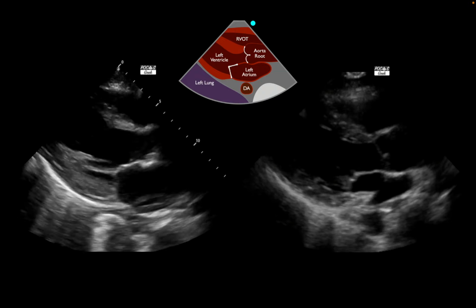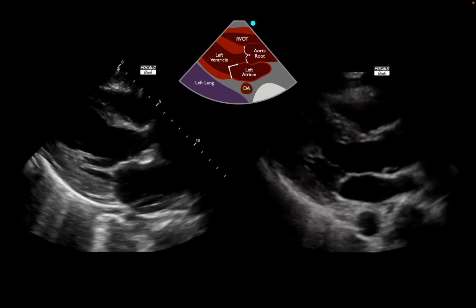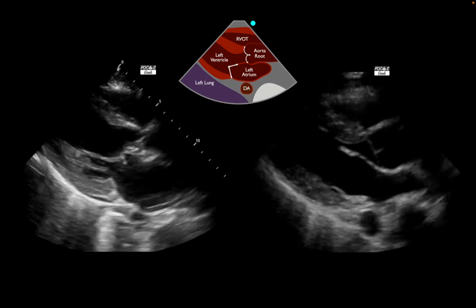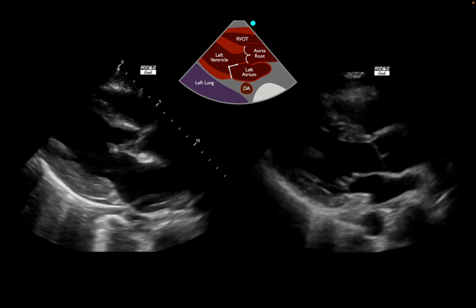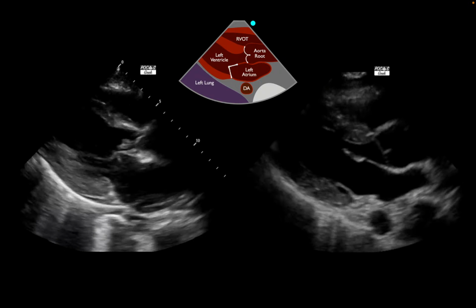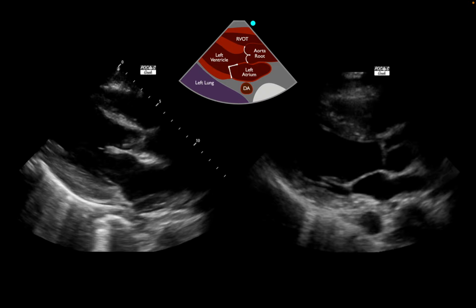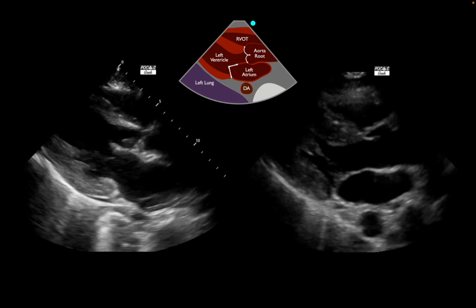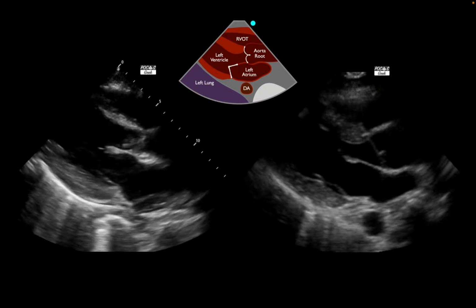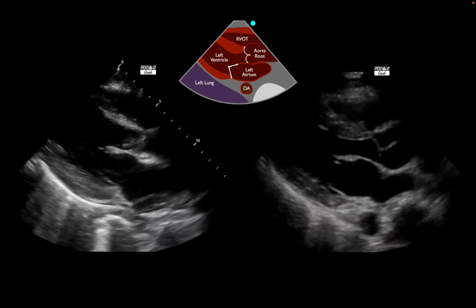from the LV backwards and get fluid in the lungs, fluid in the abdomen, fluid everywhere. It's going to third space. And so this is just a chance to recognize that. That is the key vital thing. Unfortunately, in this video we only see it in this one spot. We could assess this further by obtaining an apical 5-chamber view, which is not done in this exam, and that's okay, but just recognizing this would be our first step in knowing how to manage this.